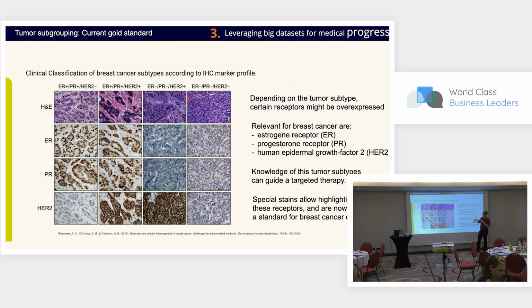So that means that in a typical diagnostic workflow for breast cancer, you have tissue that is cut and stained with different chemicals. All of these, of course, need to be paid for. It costs something. It's not thousands of euros, but also not tens of euros. You will then have those images. Someone will have a look at all of them, and categorize them and tell you, okay, is this rather active or inactive? And of course, there's lots of space in between.